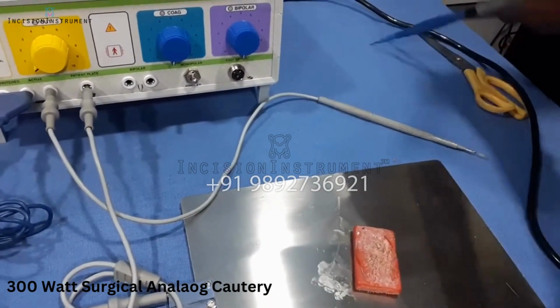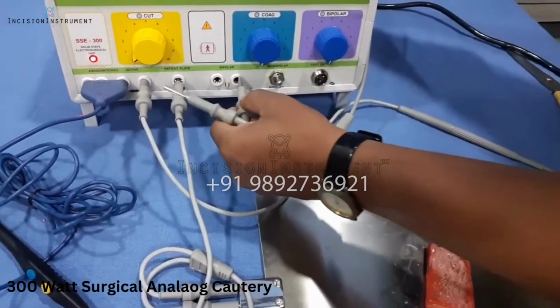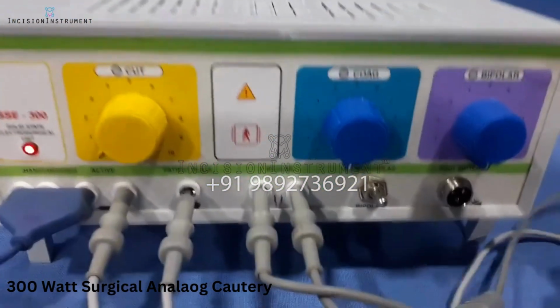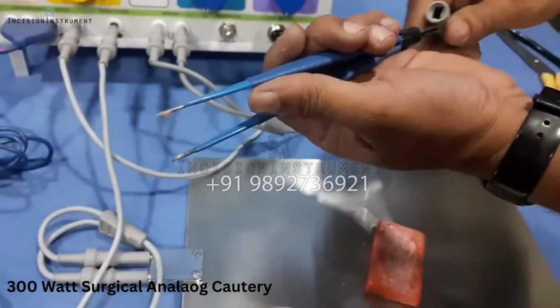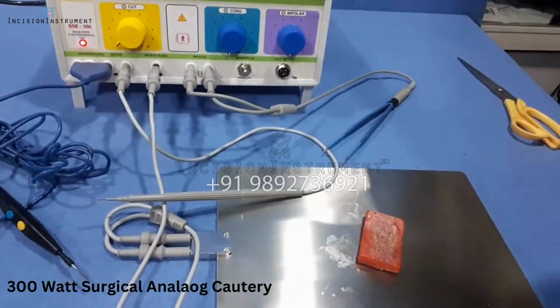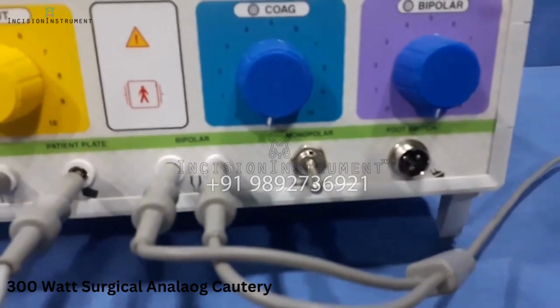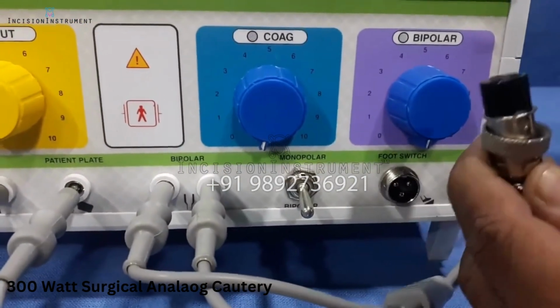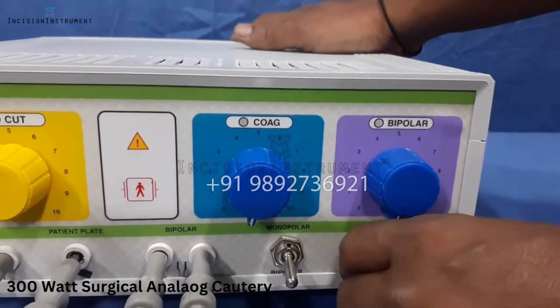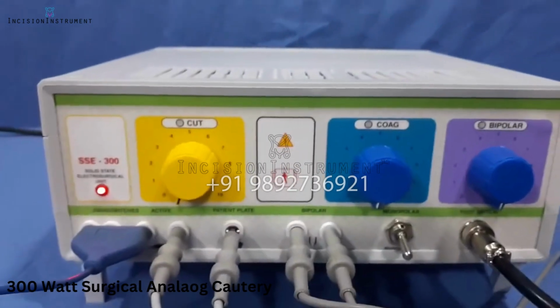Bipolar, you have to insert a bipolar. Two pins here for the bipolar forceps. The detachable forceps is given with the machine. Toggle switches for the monopolar and the bipolar. Only a single foot switch for monopolar is provided with the machine. The 3 pins connector, you have to connect it here. Tighten it. All the ports are on the 0 mode now.